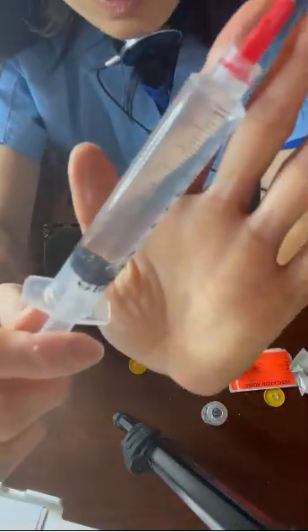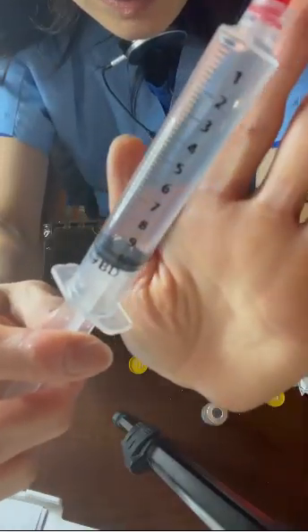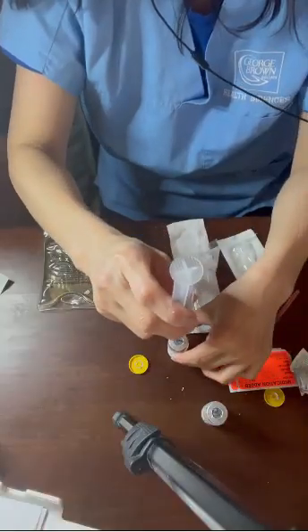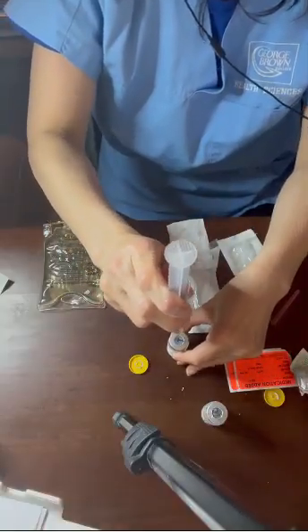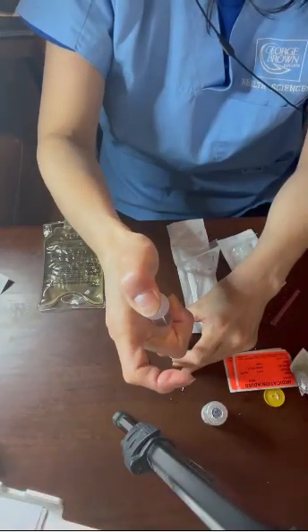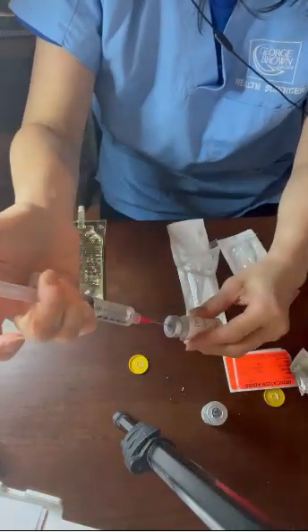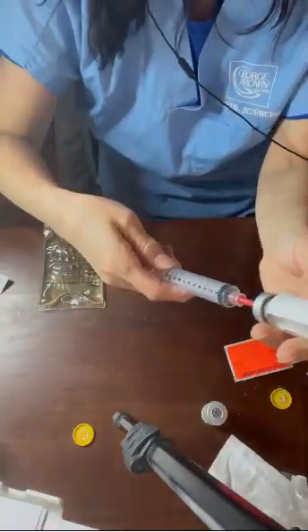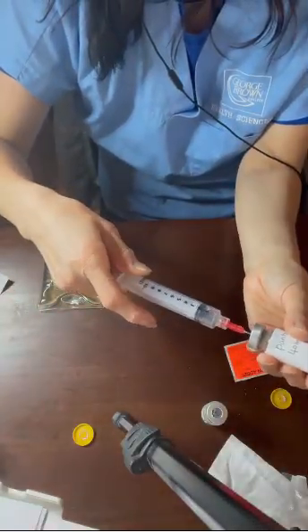So it is exactly 10 milliliter. And I'll mix with this pantoprazole powder. And draw 7.5 milliliter.